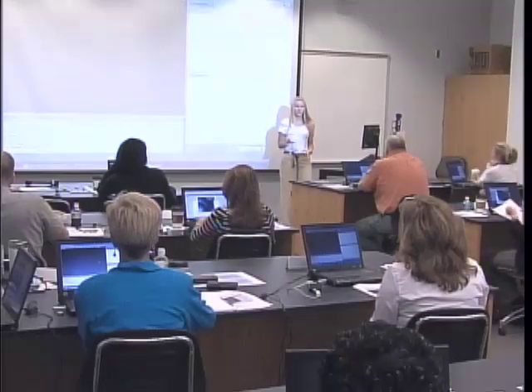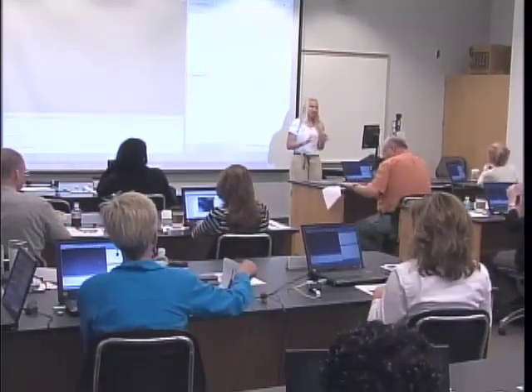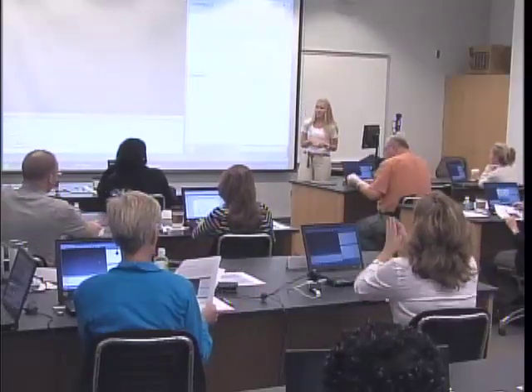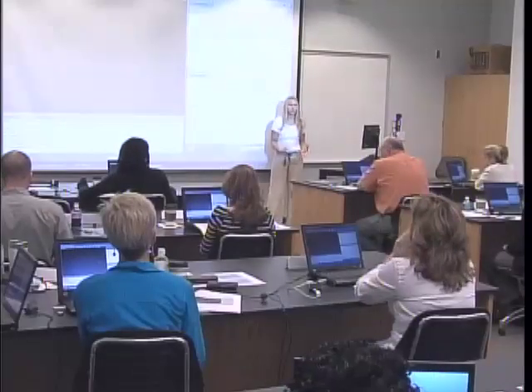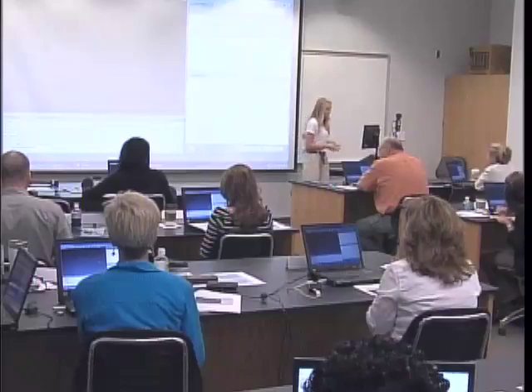In your hands-on instructions, I believe everyone has that. I'm going to try to follow those a little bit step by step, because we really did write out every single detail of how you're going to be going through this process. For the very first steps, we do reference the pool quite often. This is the properties area, and then along the bottom you have the console and also the help browser, if ever you need some help.